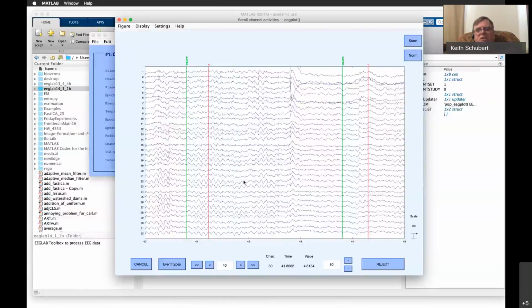Yeah, you'll see this. This is very characteristic of a blink. So you can see this big old spike coming off. So these probably are the eye channels. This one's in the negative direction, but again, remember that's not a big deal. It's just measuring if your electrode to its reference is reversed. So there's at least one big activity that's removed.